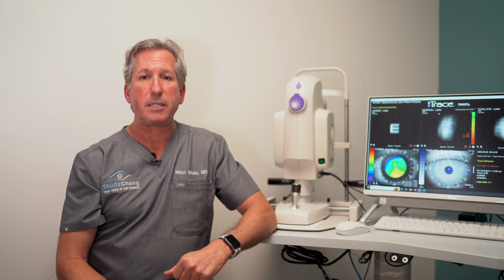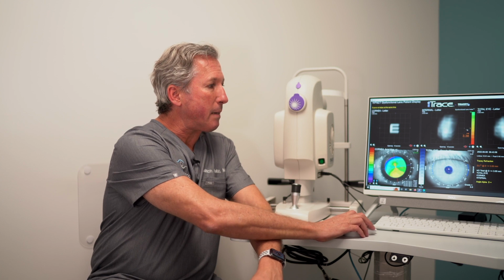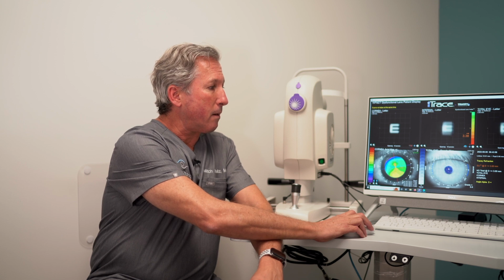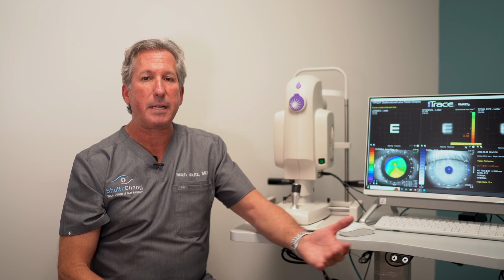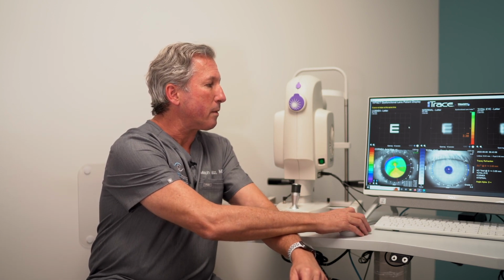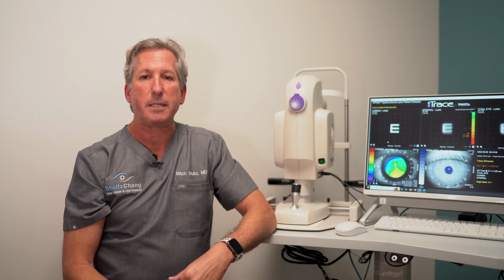When counseling a patient about cataract surgery, we can use this very powerfully because we can demonstrate to them what things look like when they don't have correction, and also when we correct them. So here you can see if we were to correct the patient's astigmatism, they can see much better. And this is a very powerful tool to be able to demonstrate to patients the power of what that astigmatism is doing to their vision.